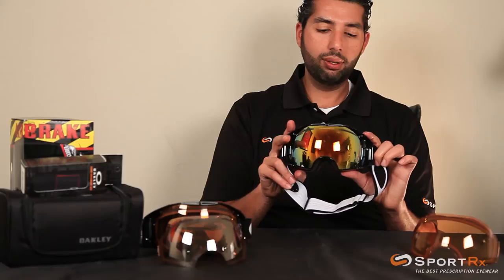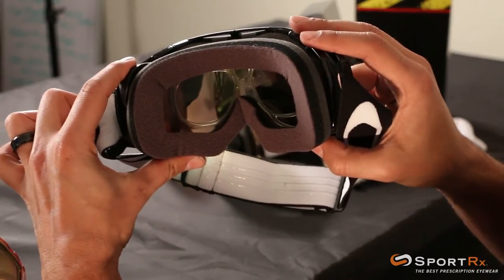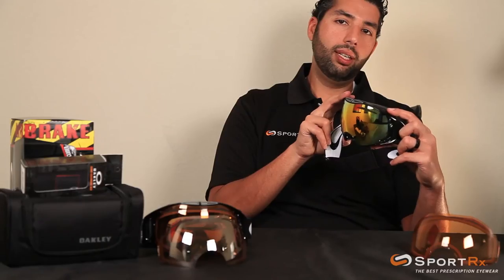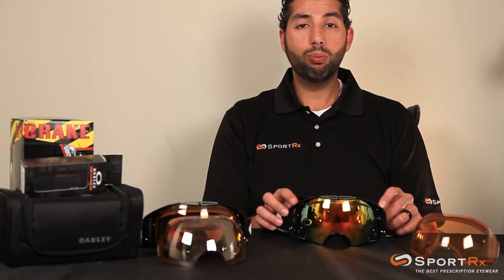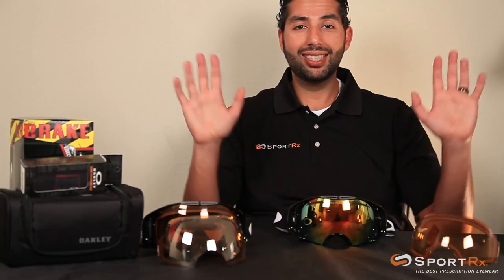When it's mirrored like that, you can't even see that they're in there, which is pretty cool. That's how you get your insert in and out of your Oakley Airbrakes. Any problems, questions, or concerns, you can email us at info@sportrx.com. If you've got some Airbrakes and you need them in prescription, we can send you just the insert — need anything, let us know. Sayonara!